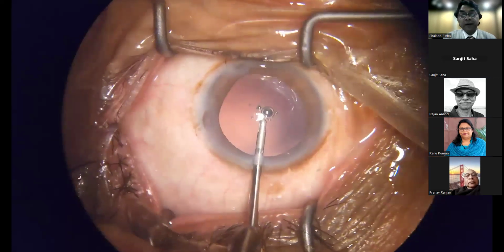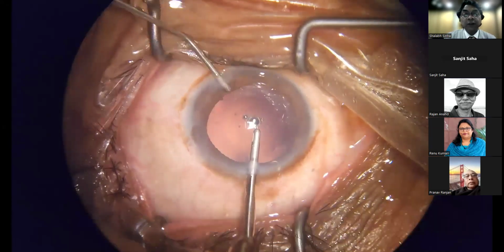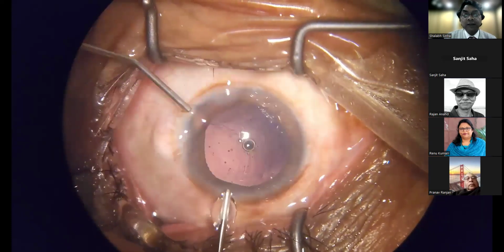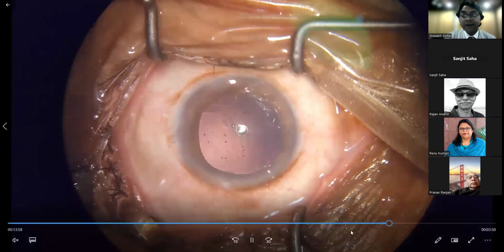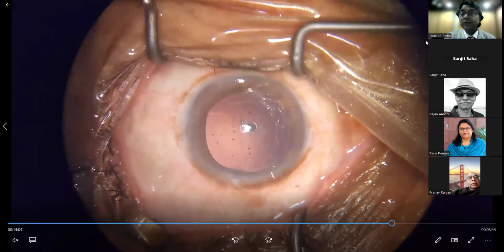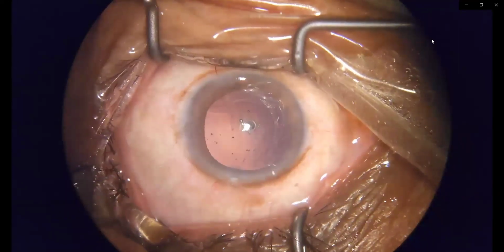When we do a visco wash after placement of the intraocular lens, you can just switch the hands. Again, viscoelastic going inside. Now come a few drops of proparacaine. Then the foldable intraocular lens is loaded. Always fill the cartridge with viscoelastic.